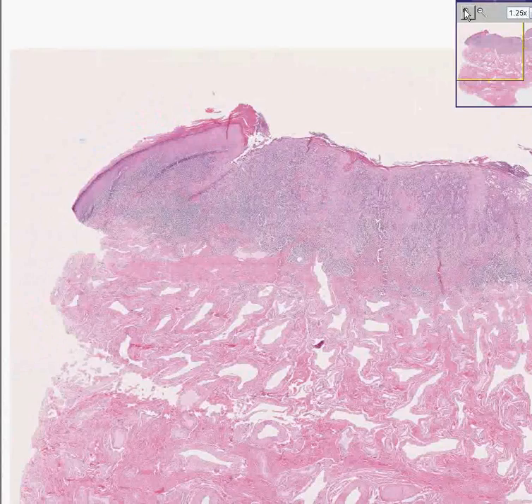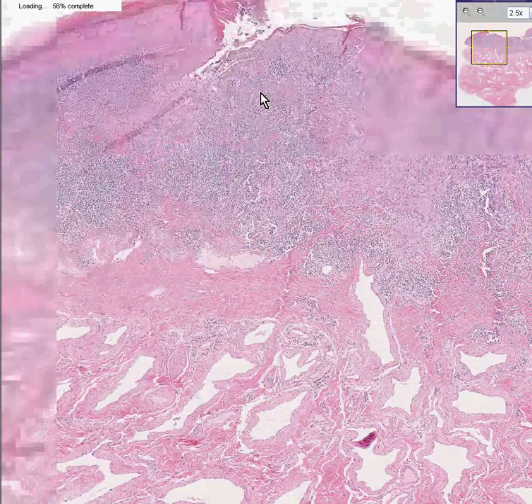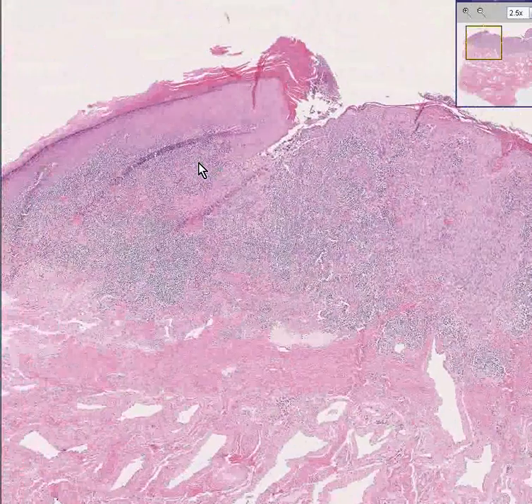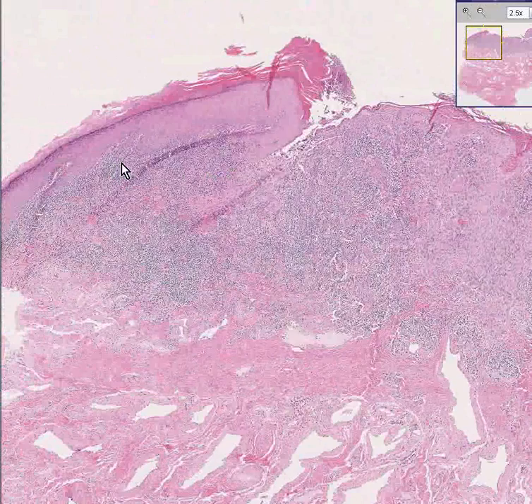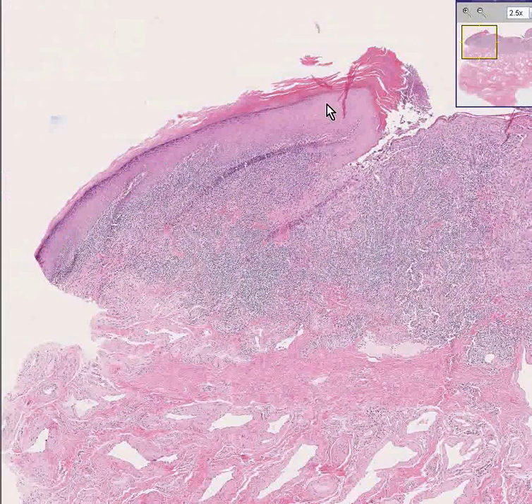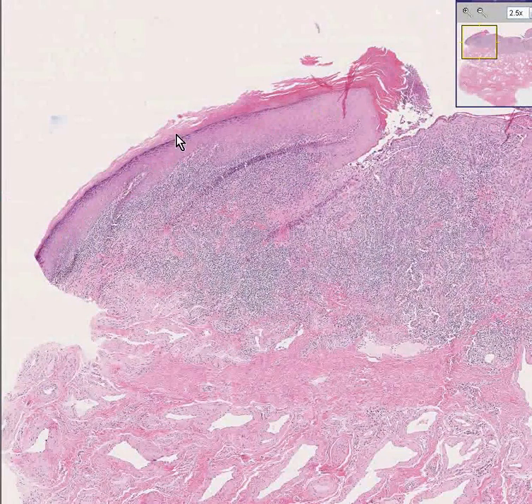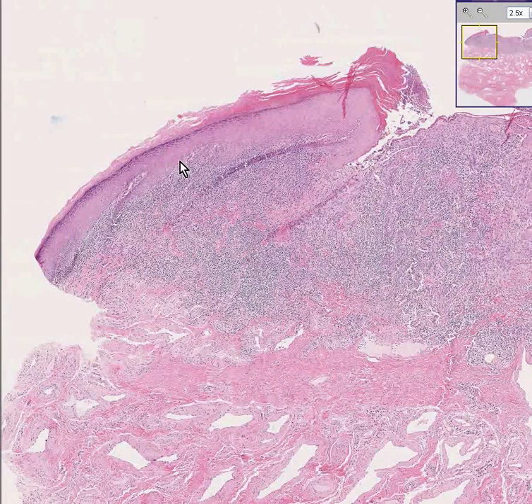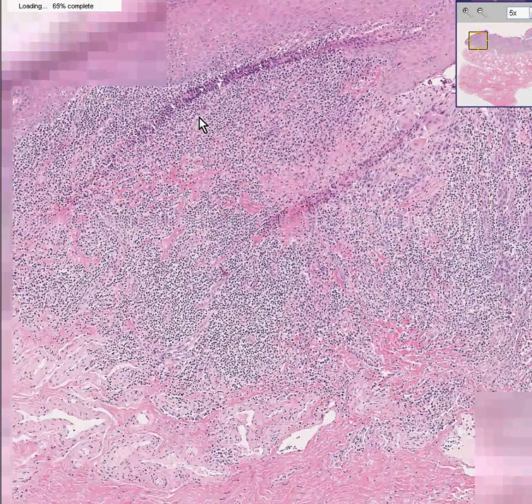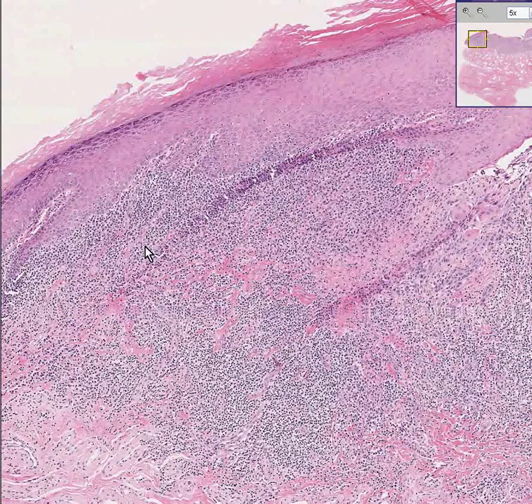So let's look at the actual skin and find out why there is inflammation. You could see that along the non-ulcerated surface there is still inflammation, but there is good maturation from the basal layer to the superficial layer. And you can see a little tissue wrinkling here as well.